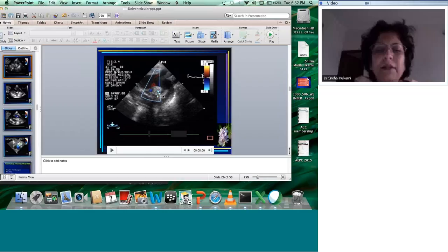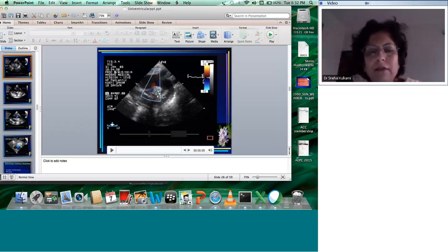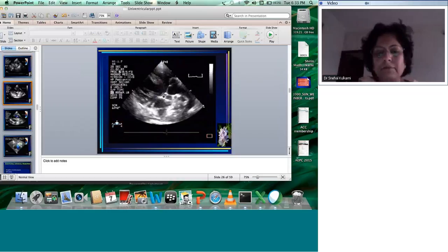You see there are multiple aortopulmonary collaterals, and when you see this kind of multiple aortopulmonary collaterals, usually these patients definitely will need angiography prior to either a Glenn or a Fontan, because we have to coil embolize this accessory pulmonary blood flow, because that will increase your pulmonary artery pressures, and we know that eventually it's a risk factor for either a Glenn or a Fontan repair. So see to it whether you are seeing these aortopulmonary collaterals, and if they are there, you have to definitely coil embolize them prior to Glenn surgery.